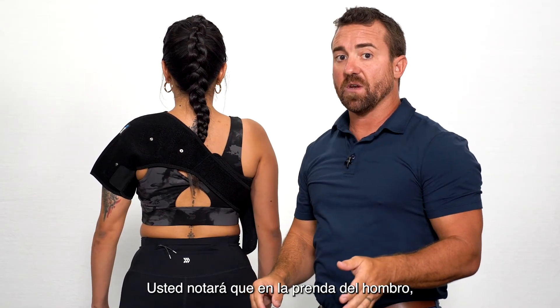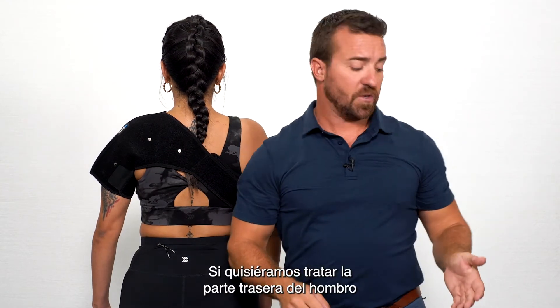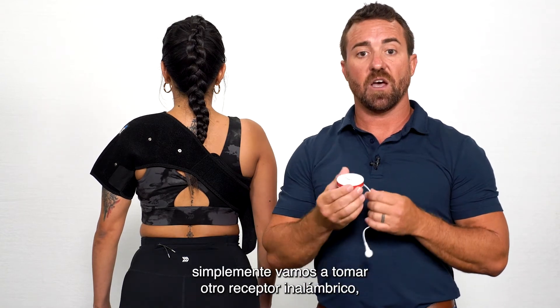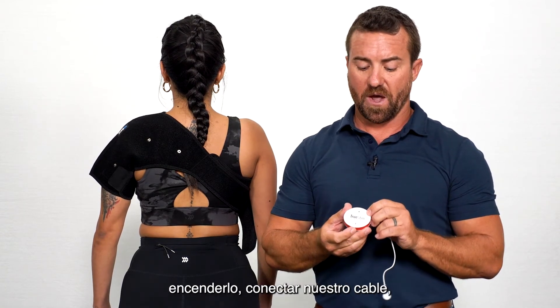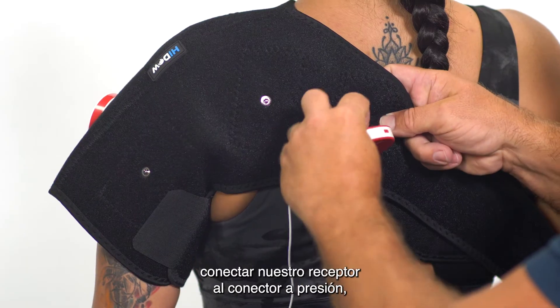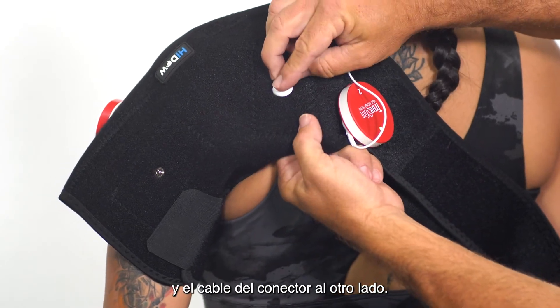You'll notice on the shoulder garment, we can also treat the back of the shoulder. If we wanted to treat the back of the shoulder at the same time as the front, we're simply going to take another wireless receiver, power it on, connect our wire, connect our receiver to the snap connector, and then connect our wire to the other side.